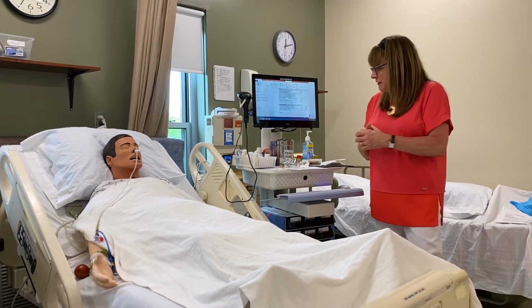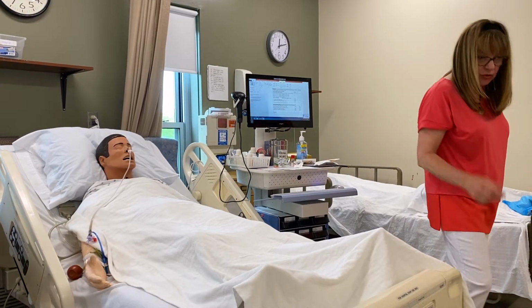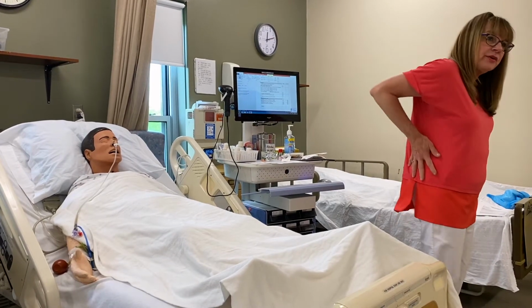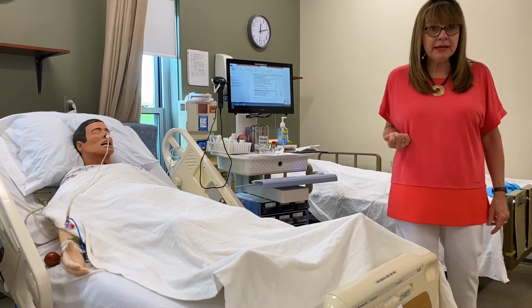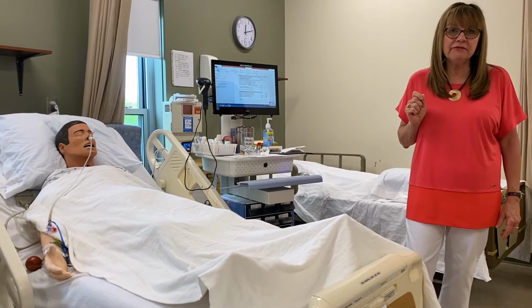So when you're giving a medication in the vastus lateralis, you can give up to 2 mLs, 22 gauge, 1 inch. When you're giving a med in the ventral gluteal area, which is up in here, you can give up to 3 mLs, and you're going to use a 1 1/2 inch needle because it's a pretty hefty muscle.